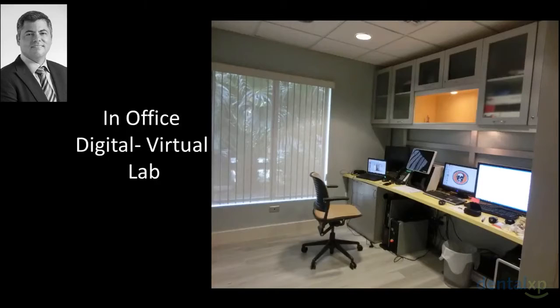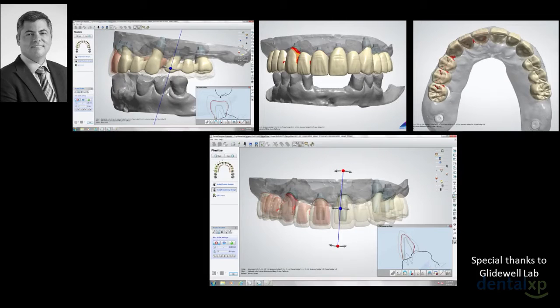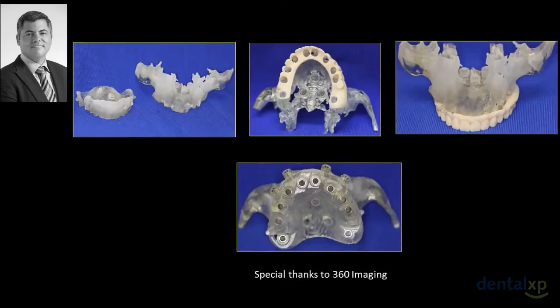Abutments, frames, and crowns can be generated from an intraoral optical impression, and the dental labs can become certified in this process to work with this technology. The communication becomes virtual, and it can all be done utilizing the internet. Models can be printed easily and at a low cost in an office or by any lab with a 3D printer.